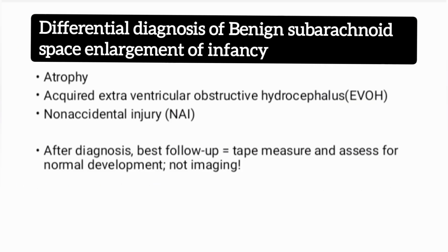Differential diagnosis of benign subarachnoid space enlargement of infancy: cerebral atrophy, acquired extraventricular obstructive hydrocephalus and non-accidental injury.